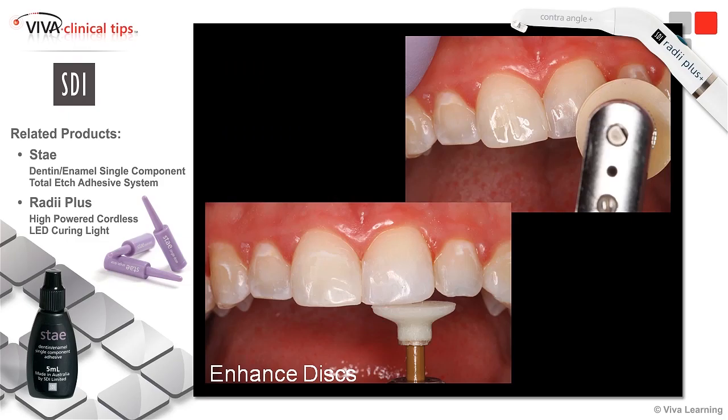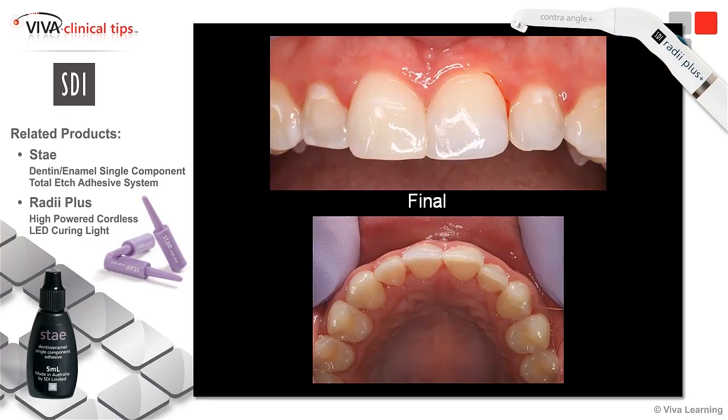From here I can use a series of discs, and I also use some enhanced discs — cups as well. I know everyone's got preferences on how they polish. The only thing I can suggest is to use a great system that's consistent and find a material that you can polish. Here you can see how beautiful — the luster that you can get off this microfill with Aura is just incredible. It's such a nice material to work with, and you don't have to futz with it. It places, moves, and sculpts nicely so you can get a great finish like this.